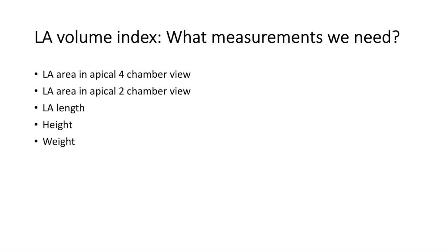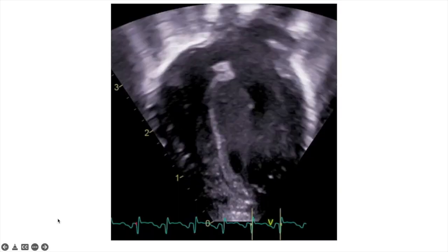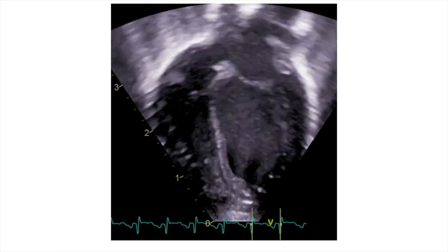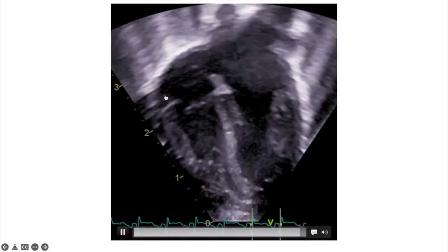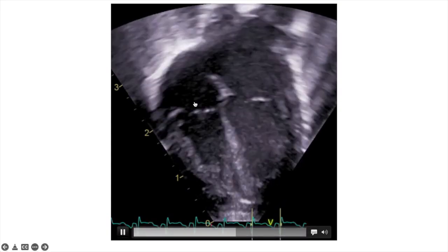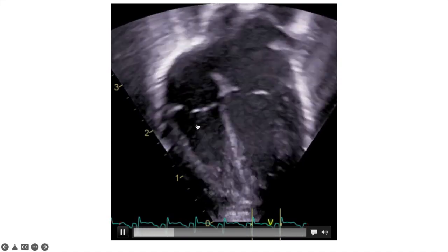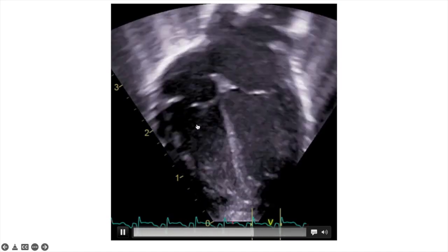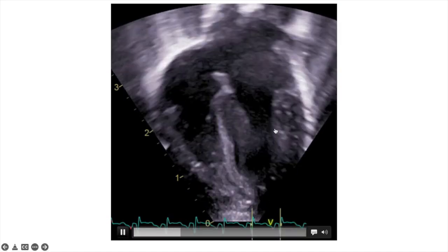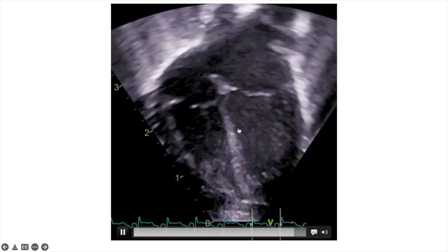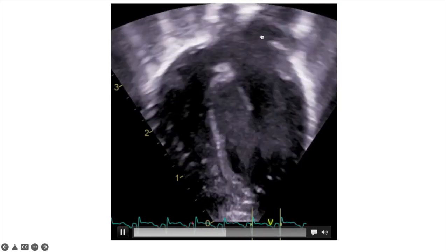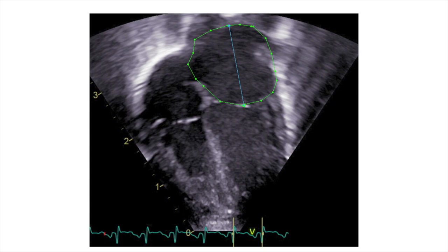This is the first view we need — the apical four-chamber view. You can see the right side of the heart here, with the right atrium on top and the right ventricle on the bottom, and the left side with the left ventricle on the bottom and the left atrium on top. We measure the area of the left atrium before the mitral valve opens, so you can see here the mitral valve is closed.